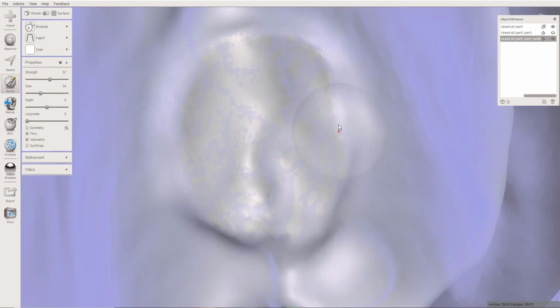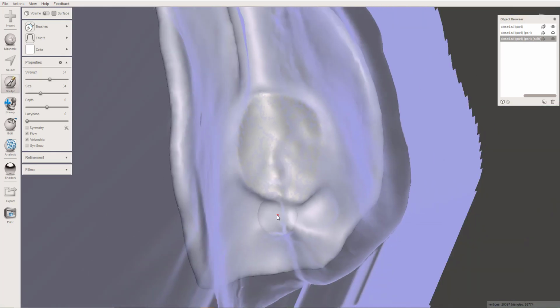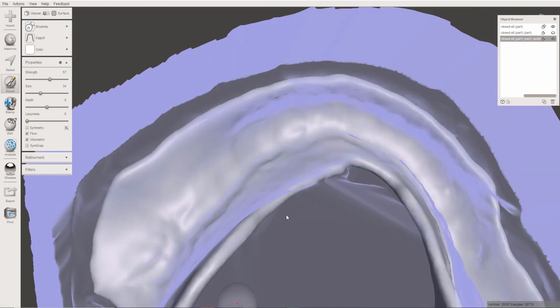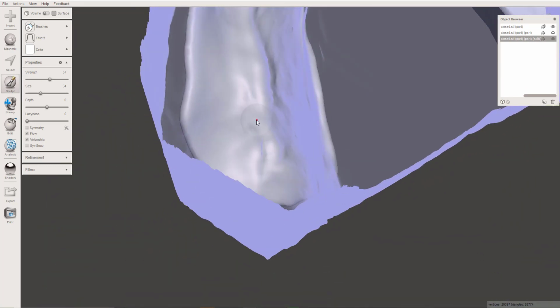I've mentioned it, but sometimes if you sit and hover too long, it'll kind of start pulling it in crazy directions. You just want to hit this, kind of go around and around in a circle until you've created that and you don't create any, the mesh crossing over itself. So now I'll go over to this side. I'm pulling this up.